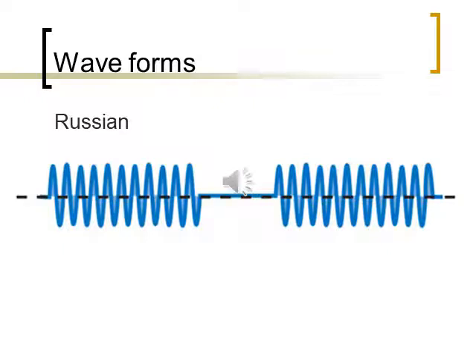It's a polyphasic symmetrical burst, because now we're getting these pulse trains put together into a burst setup to create your Russian stim. Okay, so it's polyphasic, many phases together, put together in a burst train, and it is symmetrical. Okay, on each side of the positive and negative line, you're getting equal current on each side of that.